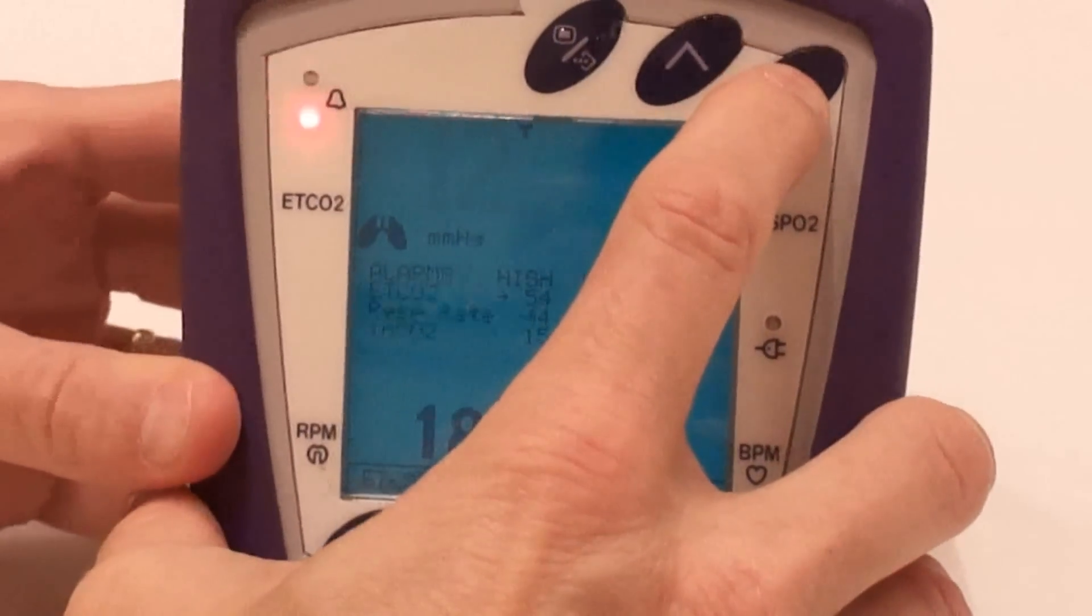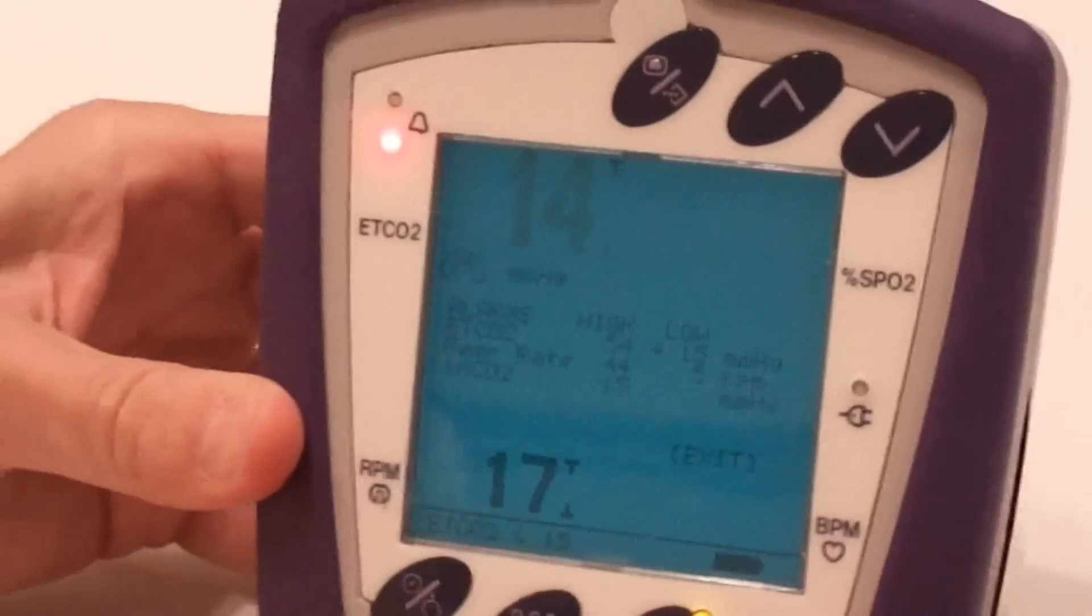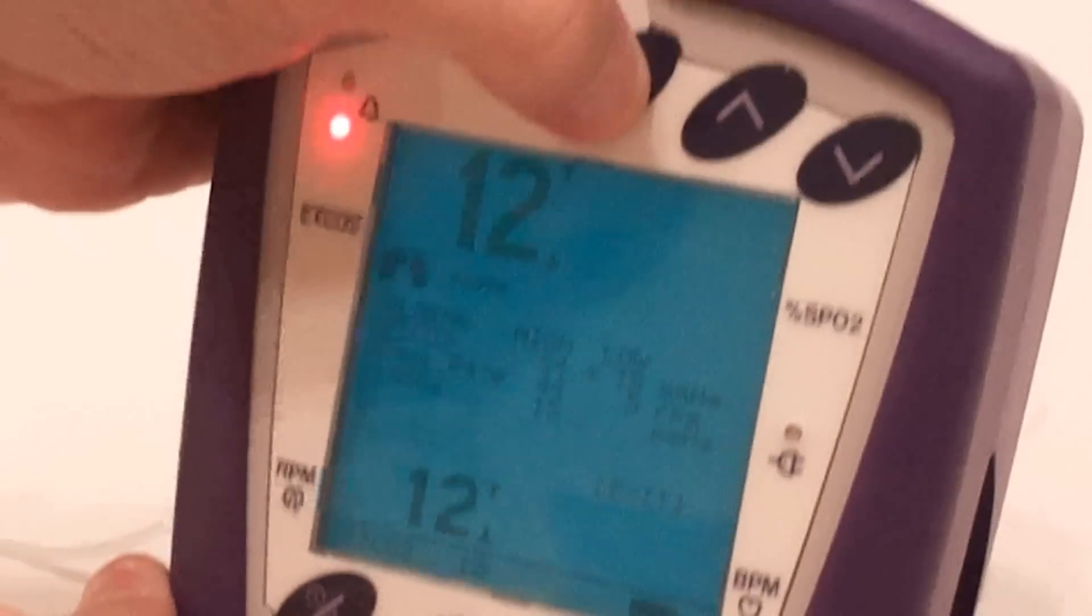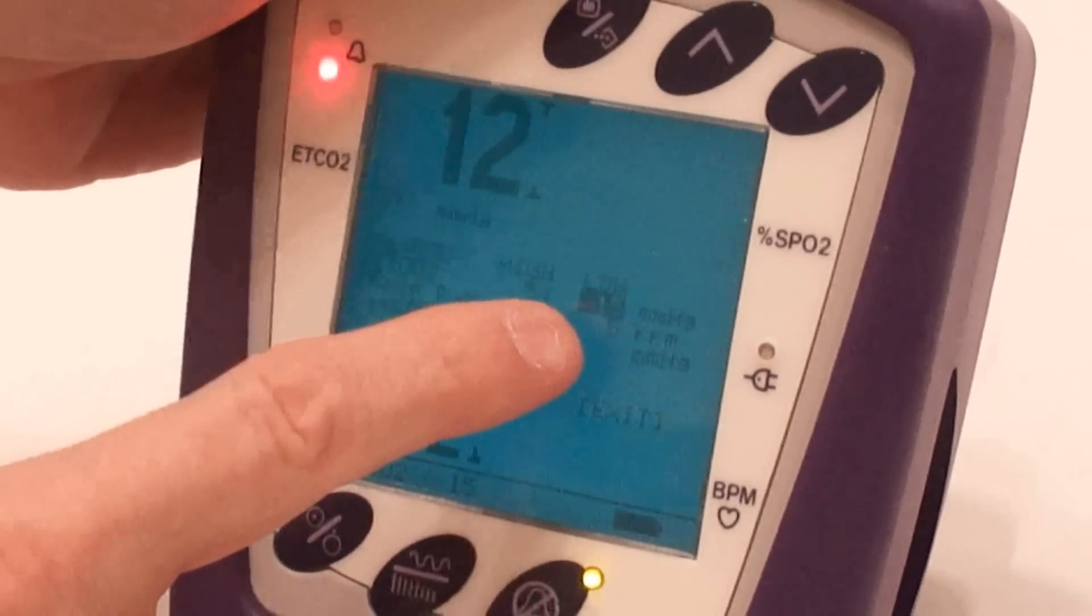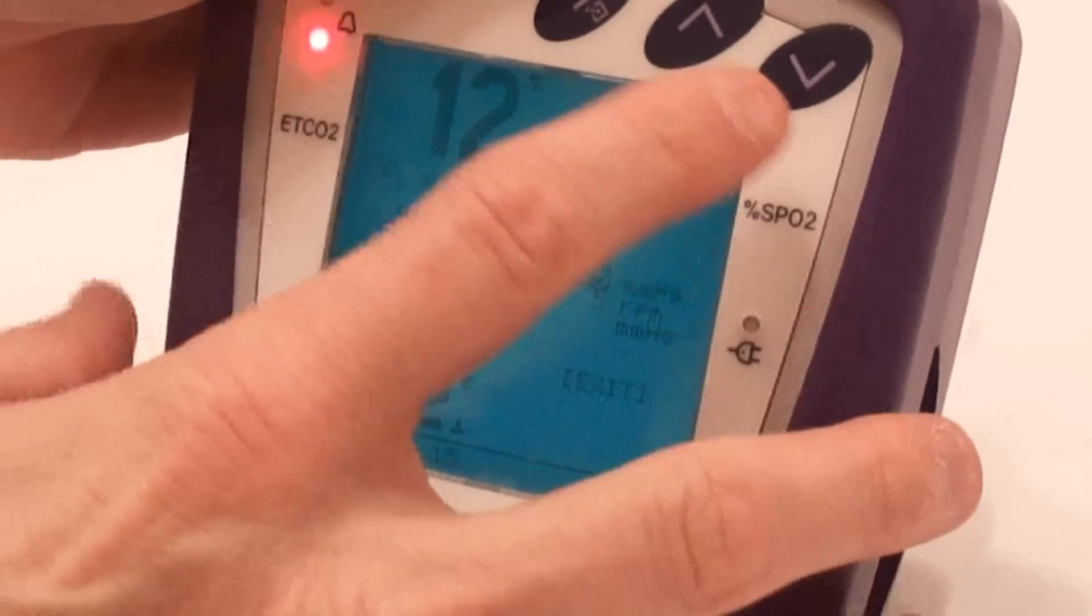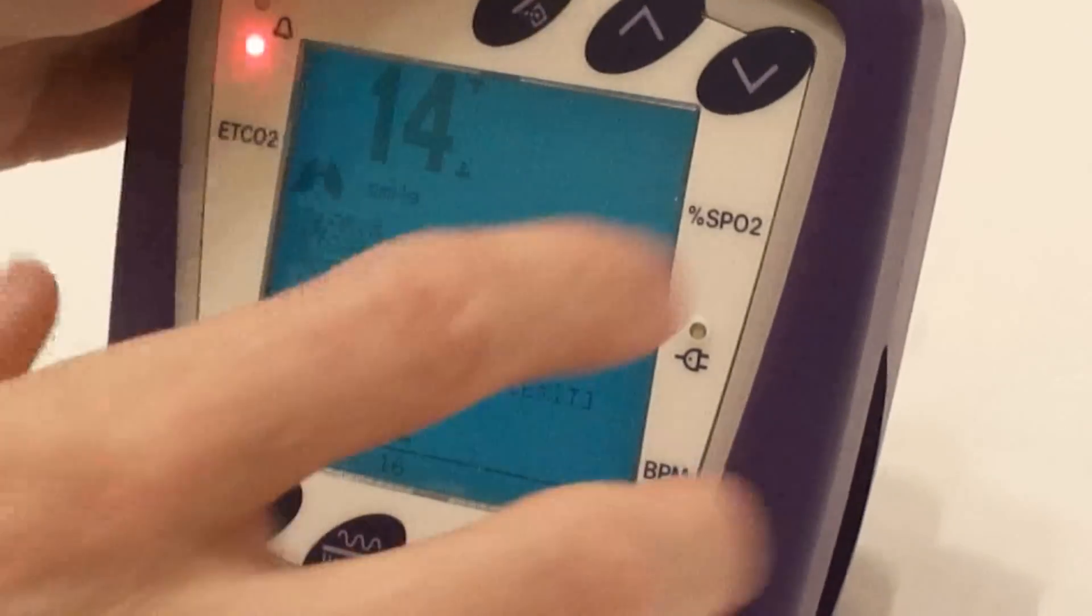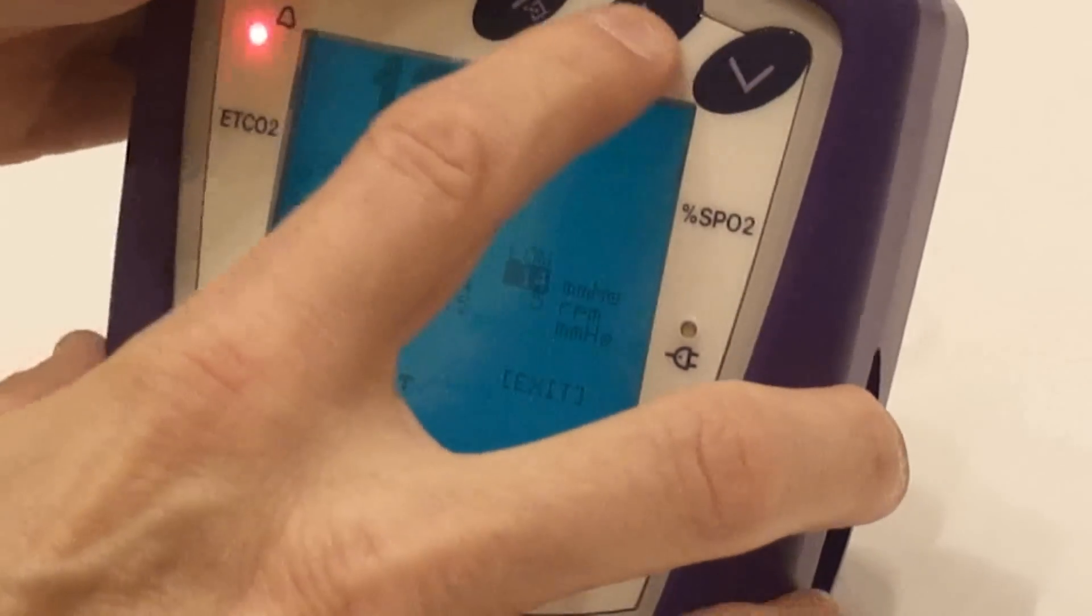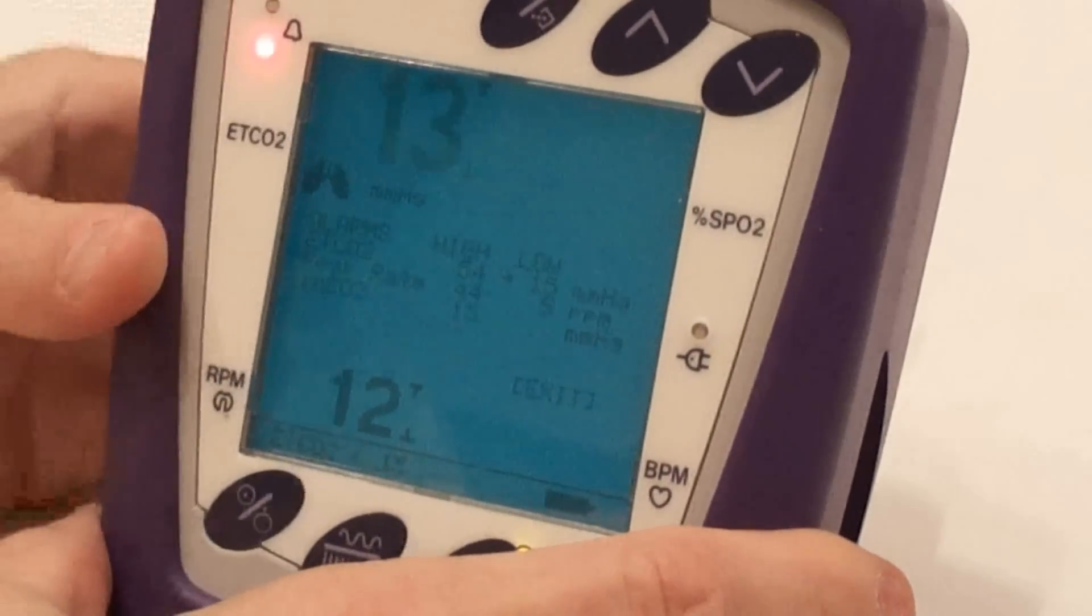Then we press the down button over here and that sends it over to the low setting for end-tidal CO2. Then what we can do is just press the menu button again. That highlights the low parameter there of 15. We can take that to 16 by pressing the up arrow key or we can take it down to 14, 13, whatever it may be. So we'll move it back right there and then we'll press the button.